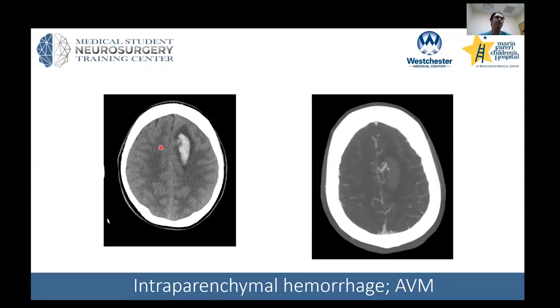This is a CAT scan showing hyperdense or bright material, concerning for blood. We would call this an intraparenchymal hemorrhage, meaning within the brain tissue. 'Intra' and 'parenchyma' meaning brain tissue.